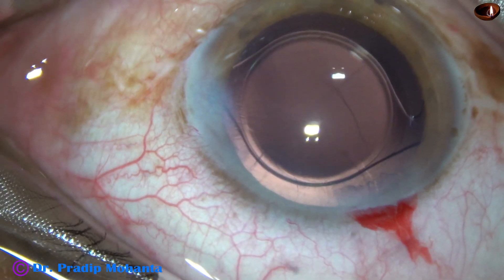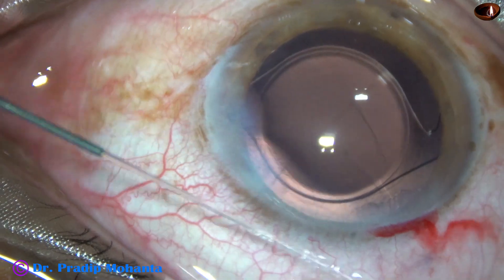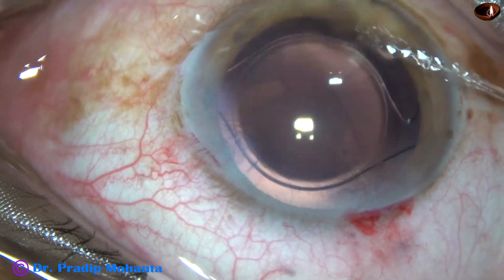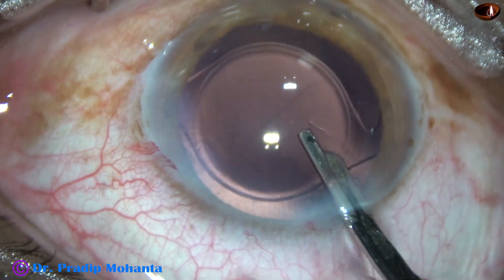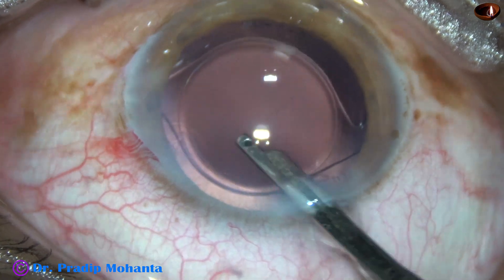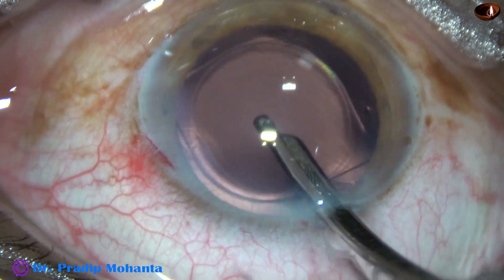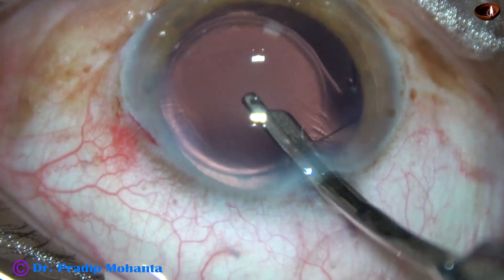The capsule will contract to some extent, and over a period of four or five months there will be a rim of anterior capsule overlapping the optic of the intraocular lens. So the case is almost done.